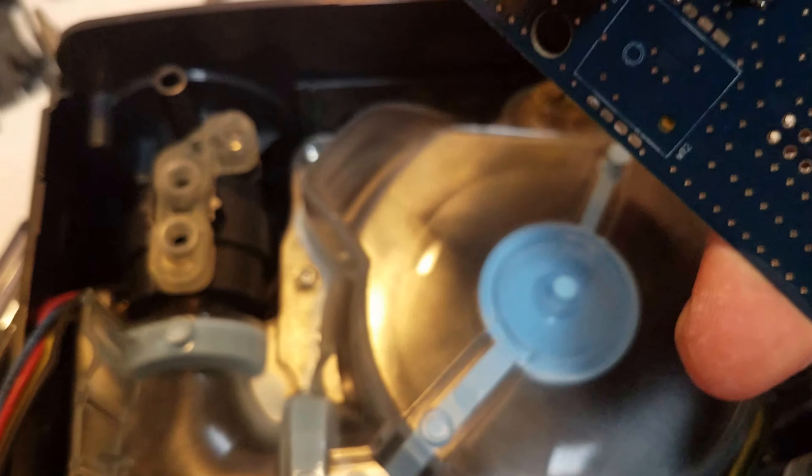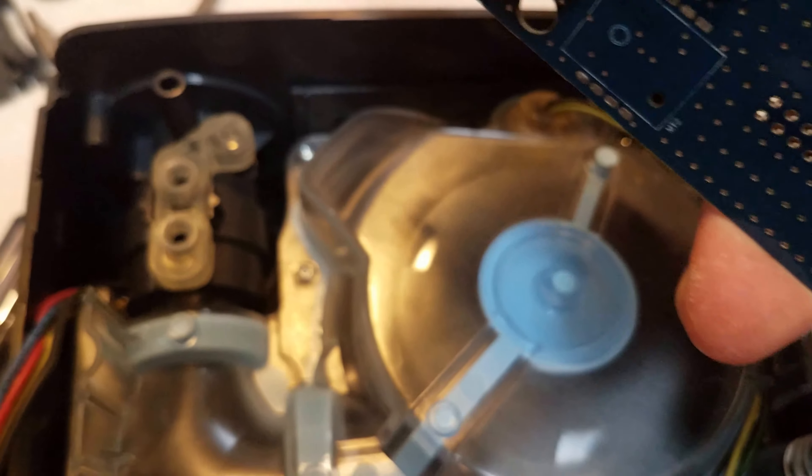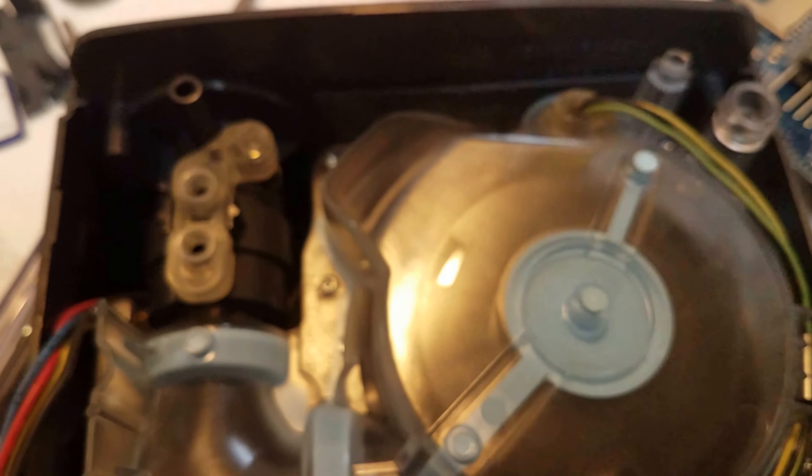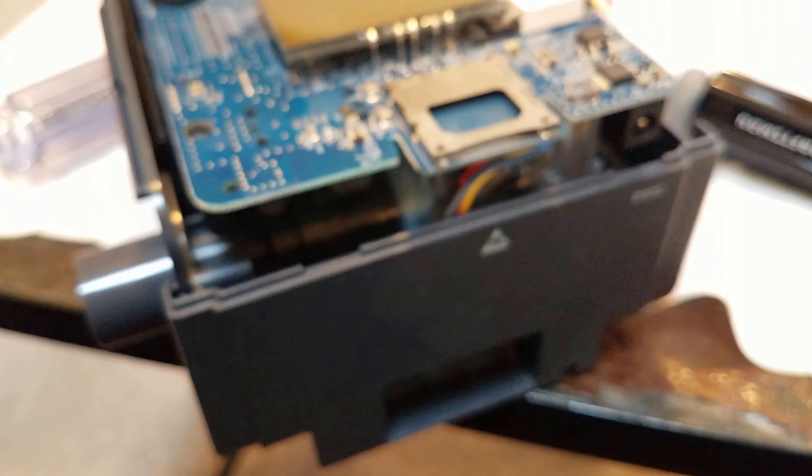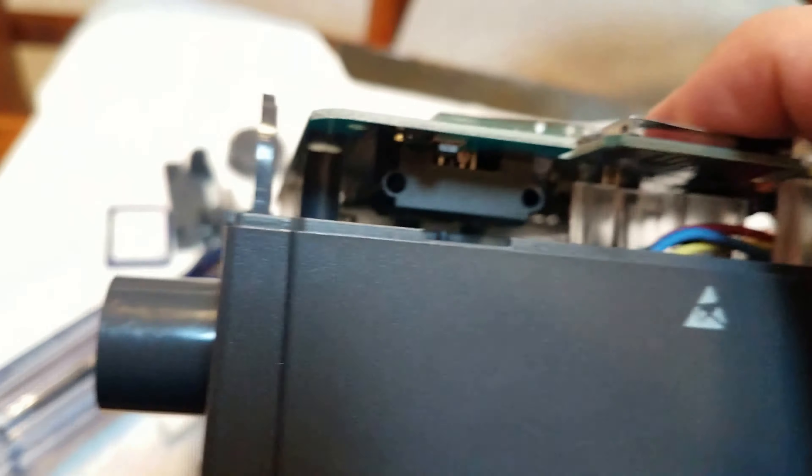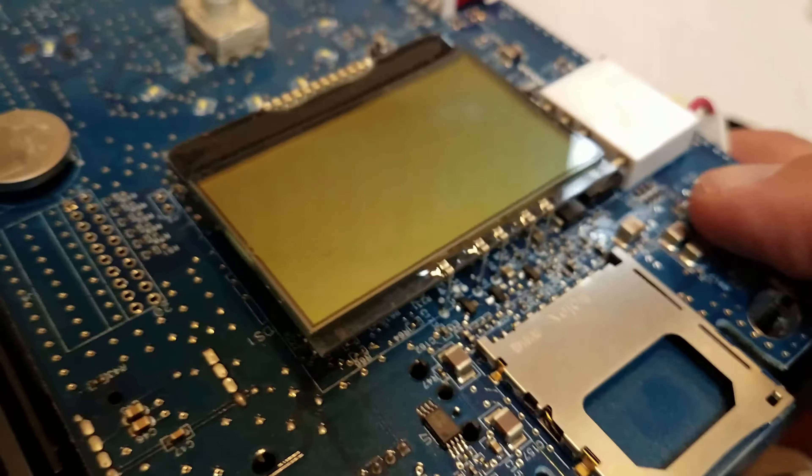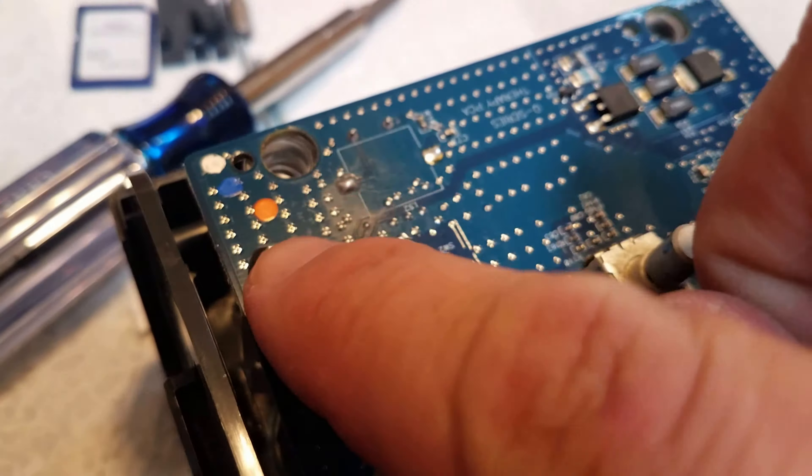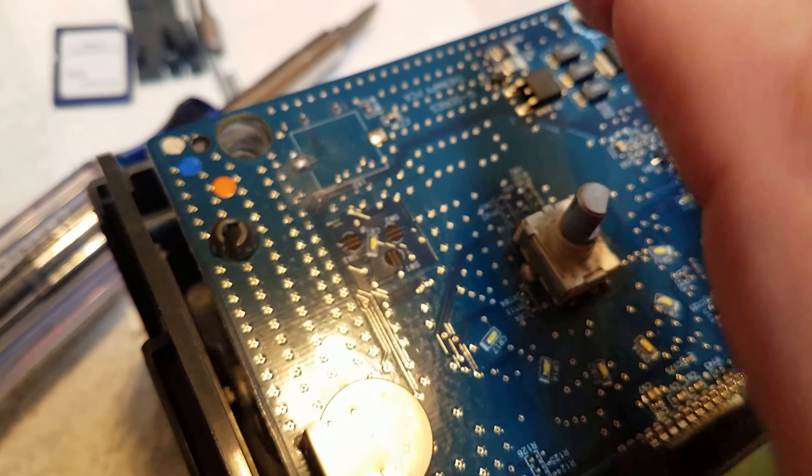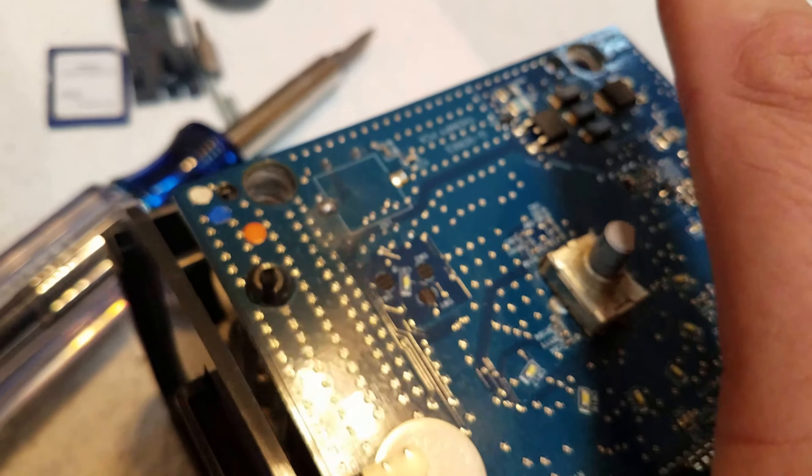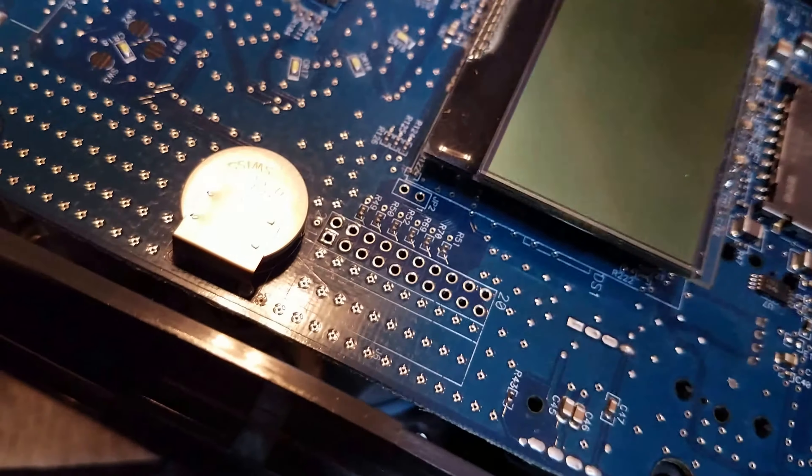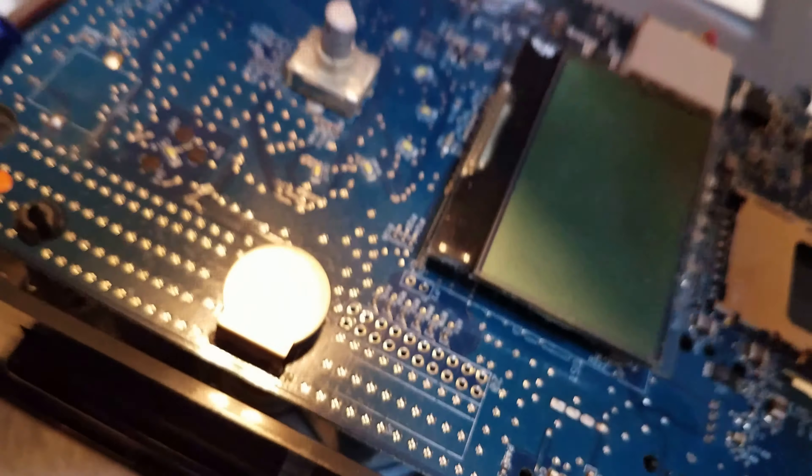I'm showing you those holes because when you put this board on, you need to make sure that those two little prongs fit into those two open holes right there. Nothing more. Hopefully you've learned that I am not perfect. I've made many mistakes on putting this back together, but nothing fatal. Those two holes, you got to make sure they line up with that little rubber cushion there and push inside so that they fit correctly. Then everything snaps, the clip there and a little clip there, holds it nice and tight.